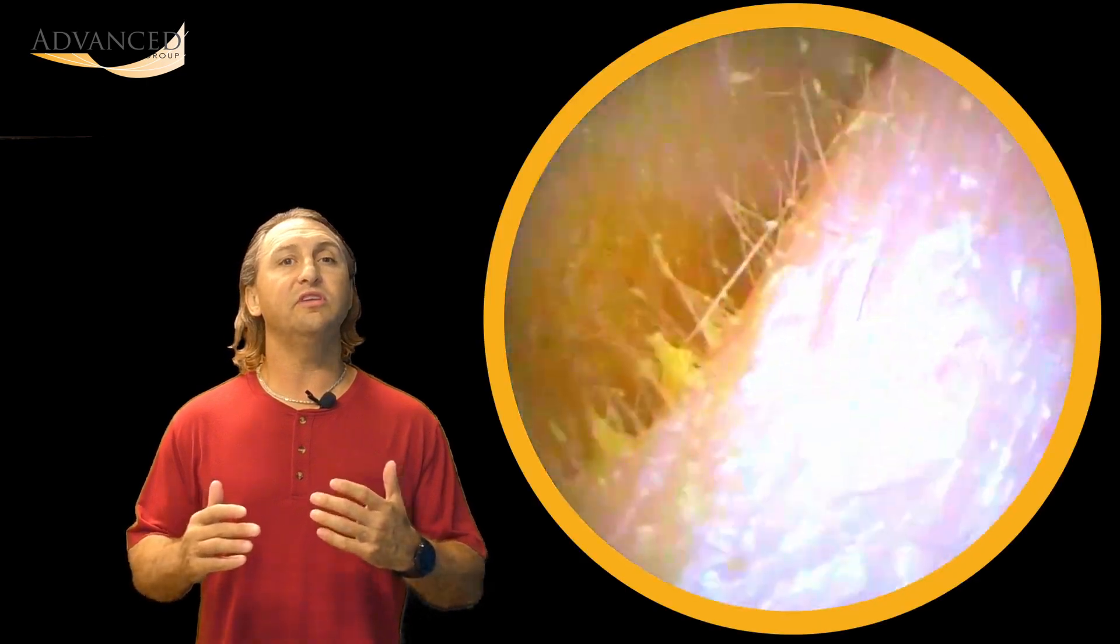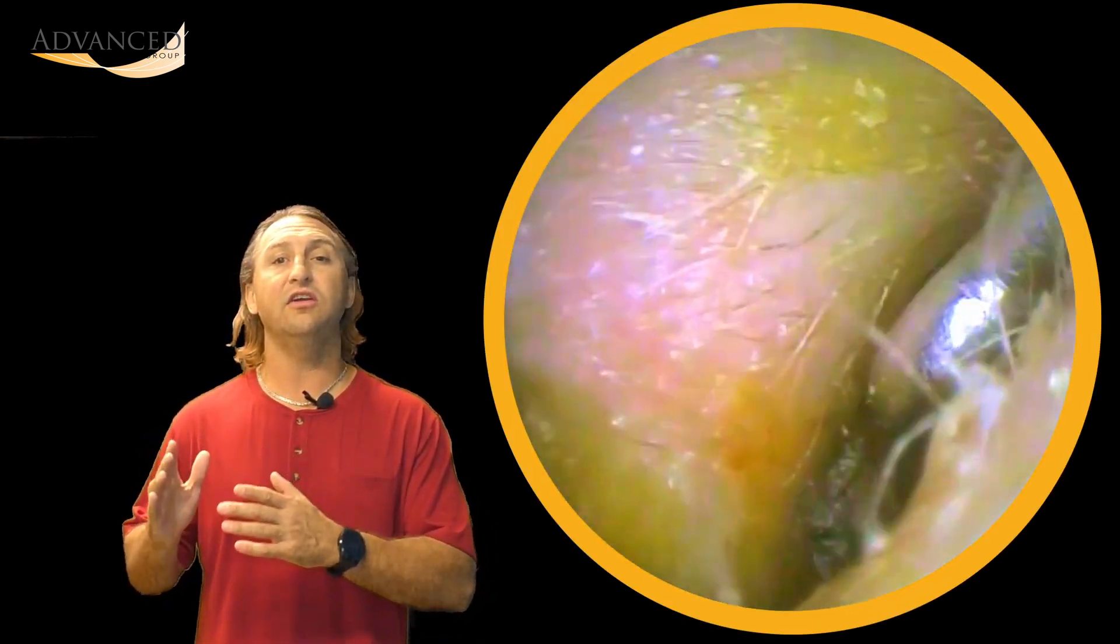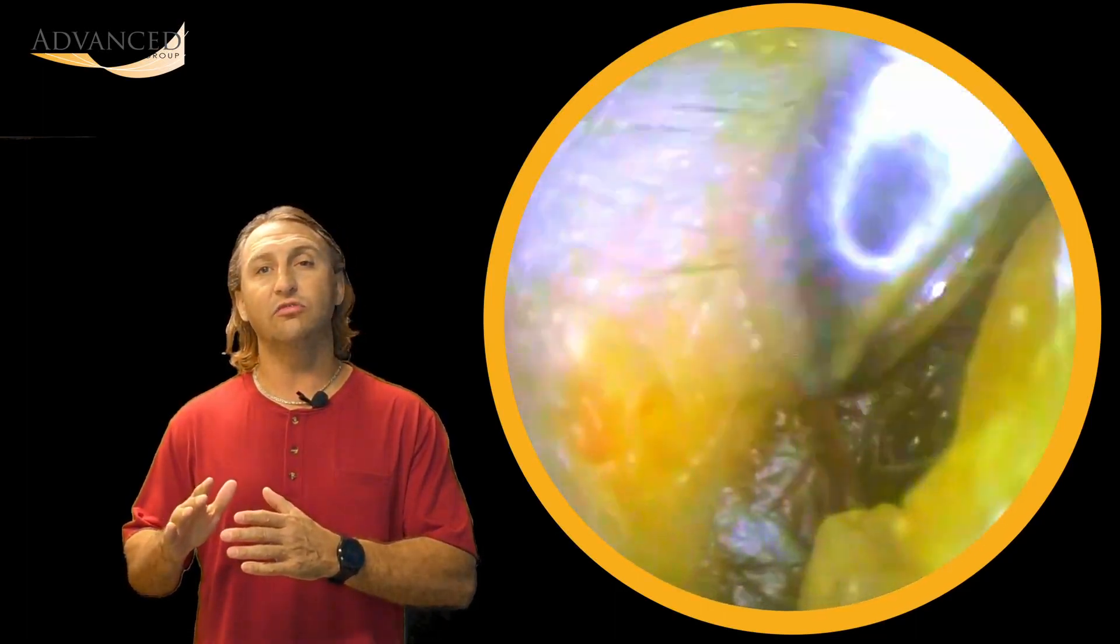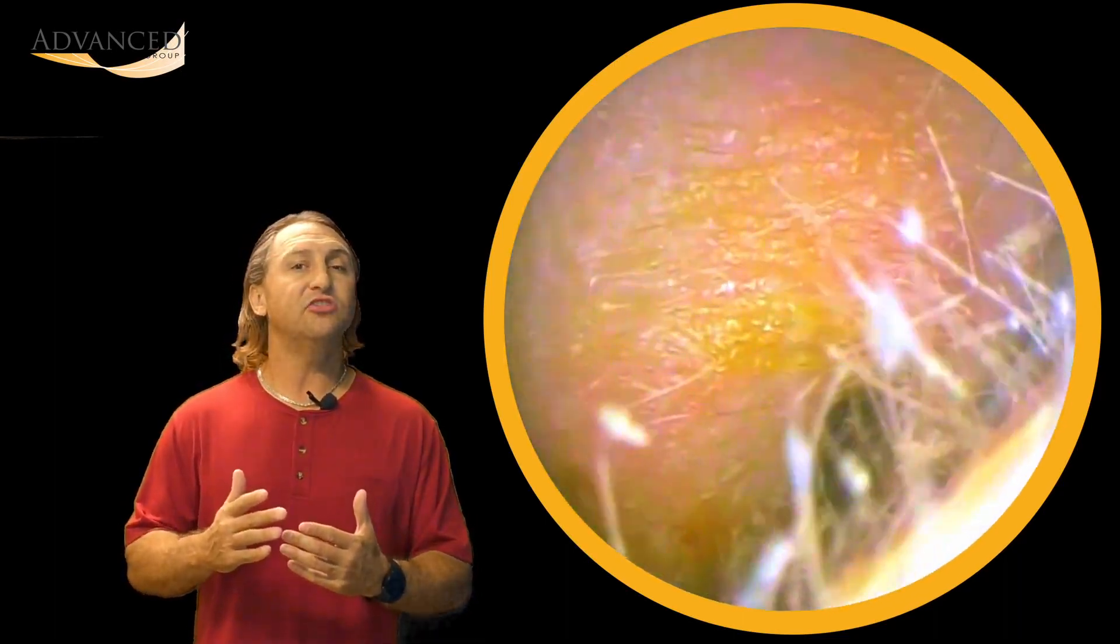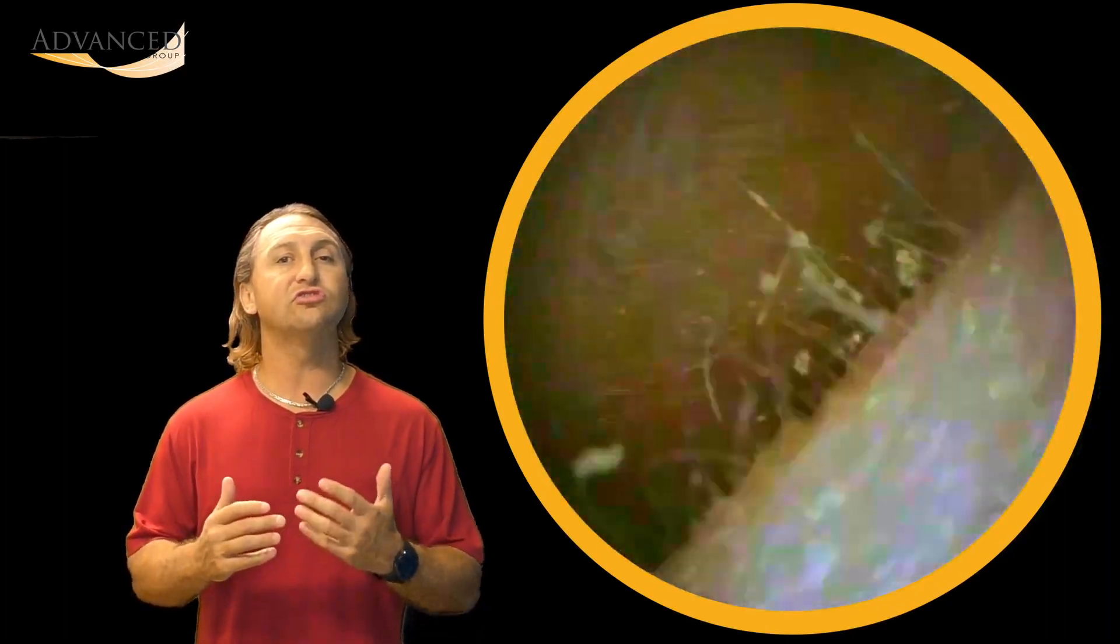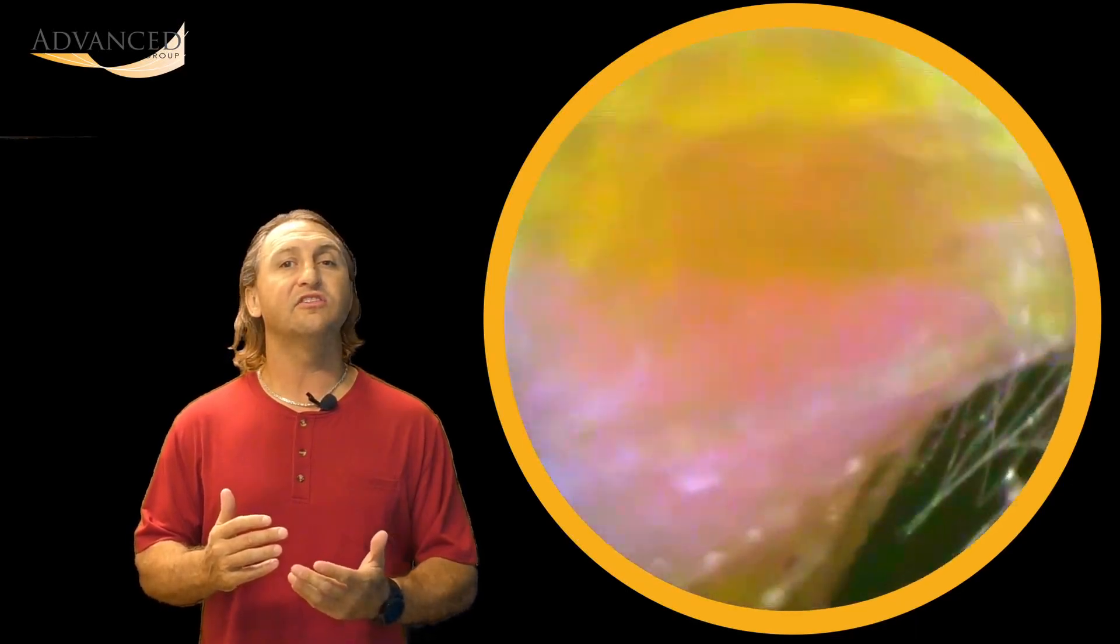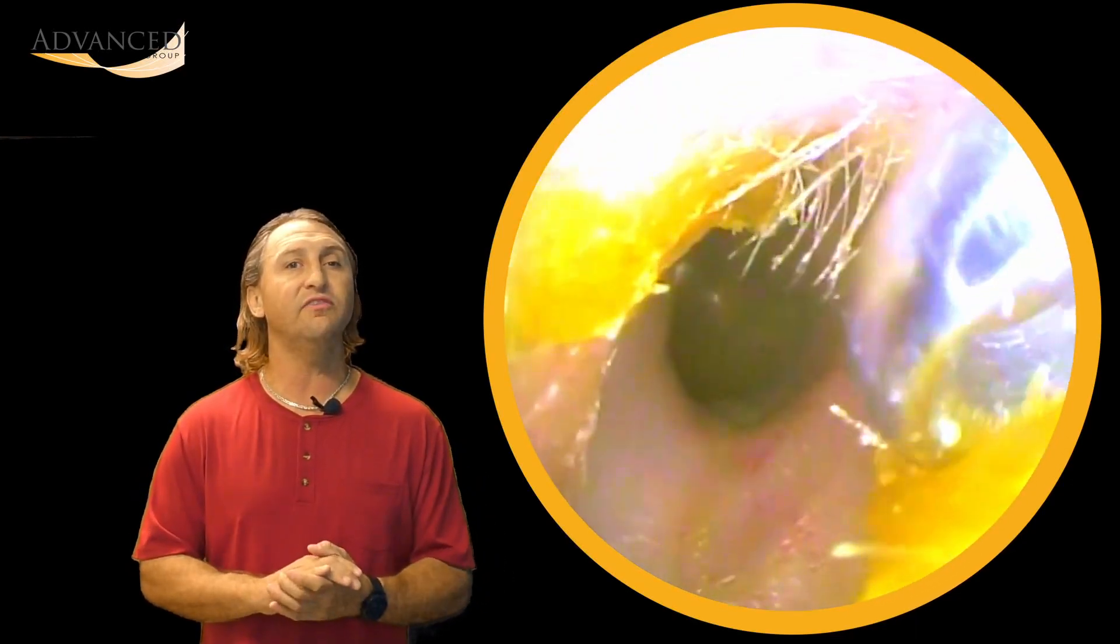We're gonna take a look next at another patient, since this is a compilation video, and we're gonna really see if they have collapsing canals on both sides. Again, here, you're seeing that curette as it goes in, and it's actually moving that ear canal wall, opening it up. What's amazing here is this patient had a sudden reduction in hearing. The sudden reduction in hearing was due just to this small amount of earwax that's kind of gluing these two pieces of the ear canal, the two sides, the right and left, together.